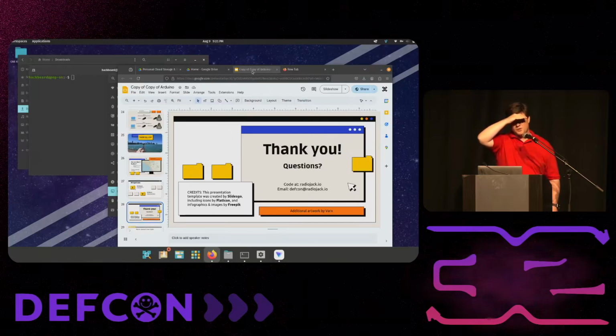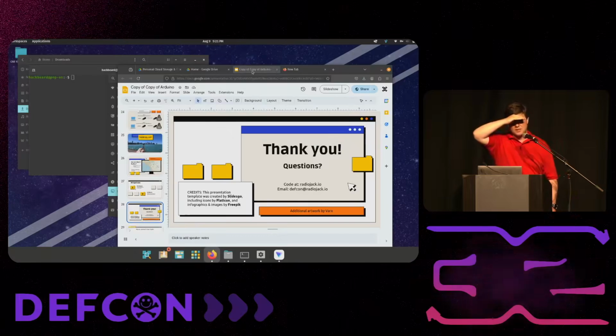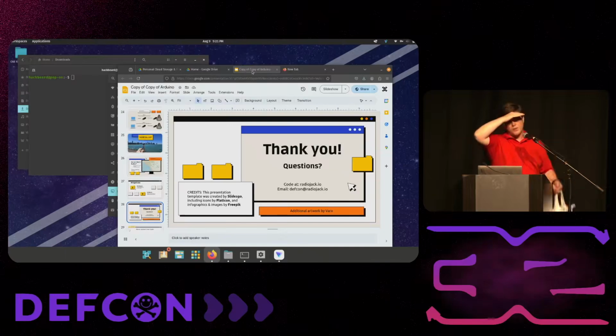So the question was, once you're connected to it, can you use it as a point to get into the rest of the network? You're right, you do have access as whoever the current user is. I haven't done that, but that's beyond just hacking into a medical device. That's one of the reasons you want to protect against this, is that now you have a point in the air-gapped network, and you are somewhat trusted, probably. So yeah, you could use that absolutely as a jumping off point.